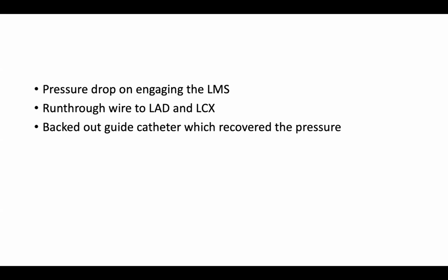Because whatever was causing the original problem can cause a pressure drop. When you are using EBU in these patients, sometimes because it's going to the aortic root and then coming up, you can keep the valve open, and the patient can sometimes get an acute AR on the background of their other problem, and then their pressure can actually further drop. Was there any pressure damping?